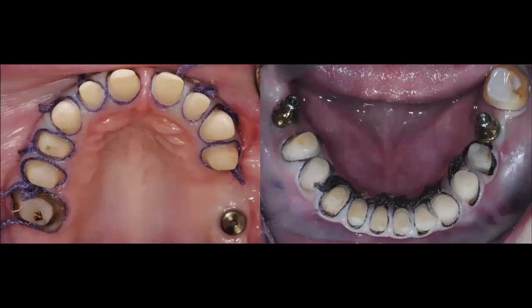So if you're looking for more aesthetic zirconia restorations in the anterior zone, or you're looking for a single tooth, why would you choose today a more translucent zirconia? Well, because we all know that natural teeth have an inherent translucency. And that's why we normally choose a lithium disilicate restoration for anterior teeth, because of the high translucency of this material, which will allow it to better match the natural translucency of the neighboring teeth if you are just doing single or maybe 2 restorations. So keep that in mind when you are selecting your zirconia restorations, because today you have those options.